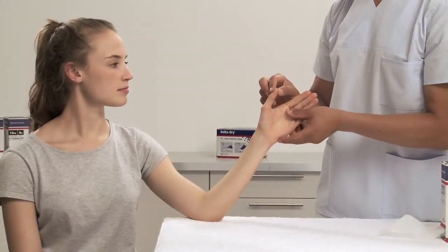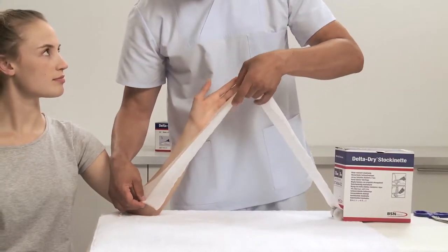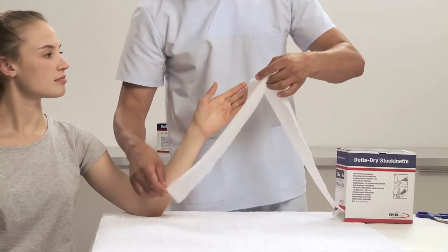Before start of application, define the position of the limb: wrist in slight dorsal flexion and neutral ulnar-radial deviation or slight supination.